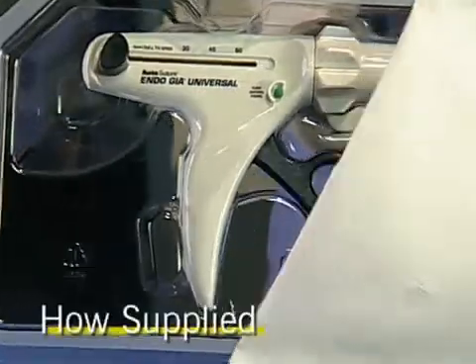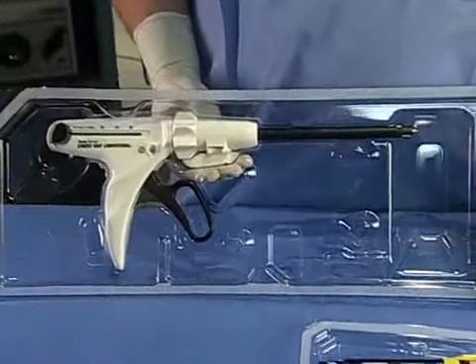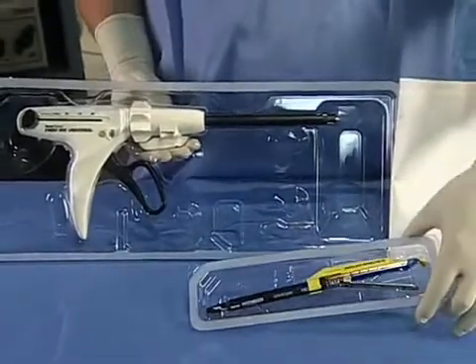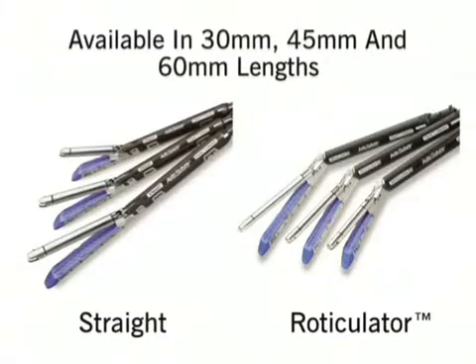The EndoGIA Universal single-use instrument handles and loading units are shipped in separate sterile packages. The EndoGIA Universal Stapler is available in three handle sizes which can interchangeably fire both straight and reticulator loading units in 30, 45, and 60 millimeter lengths.